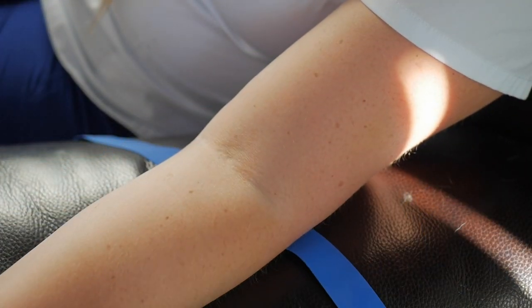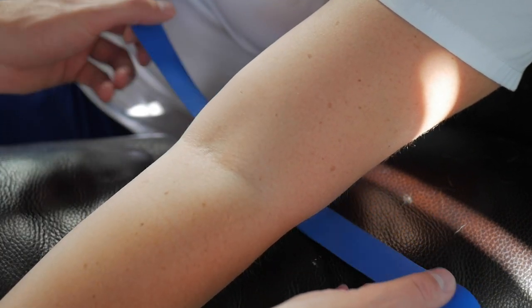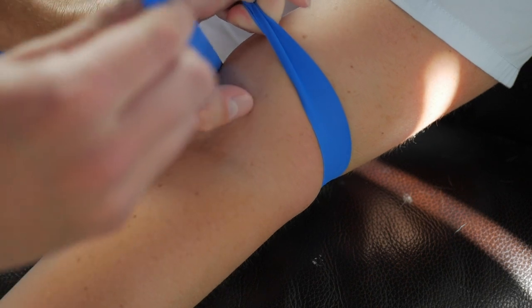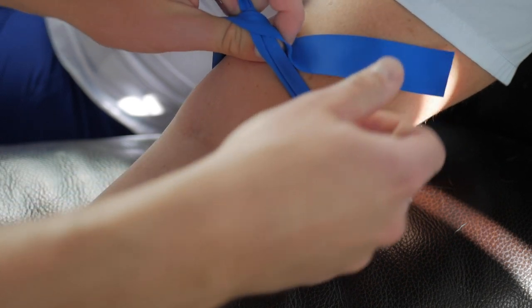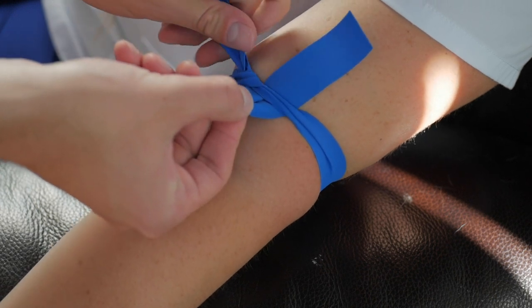Alright guys, we tried to do a little bit of a close-up and some slow-mo to help you see this better. We're going to put the tourniquet a couple inches above our site, cross the ends over, and then what I do is lift the one we're going to be going underneath with my thumb. You can see how I have it tucked under like that, and then I use my index finger to push it through a little as I'm pulling.